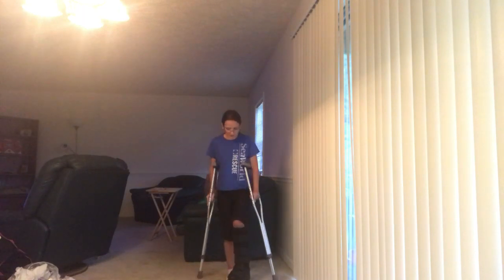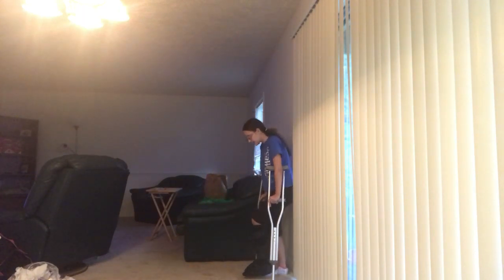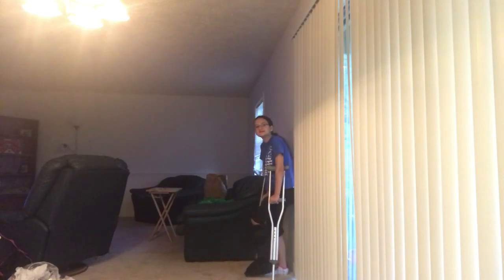But in order to show you what I mean, I'm going to turn to the side. I'm going to back up here. And now that I've been on crutches for 3.5 weeks, I'm doing the step through method, which is where I place my crutches and I step my foot through. That was a little bit exaggerated to show you, but I'm stepping through the crutches.